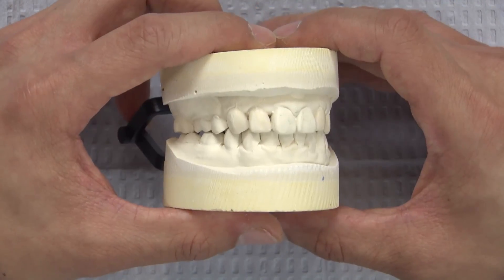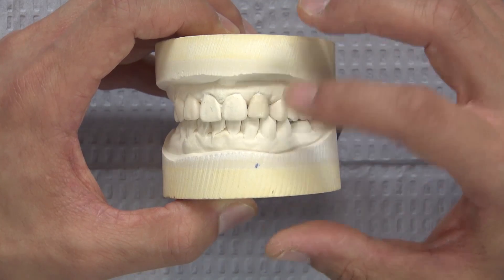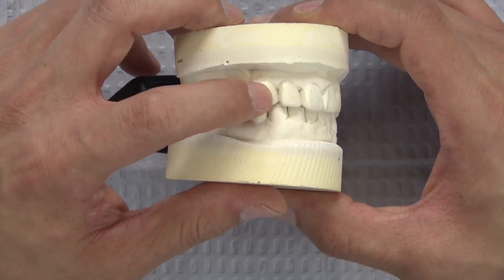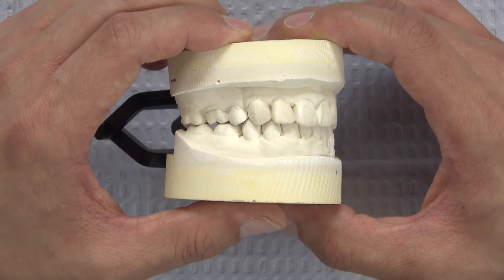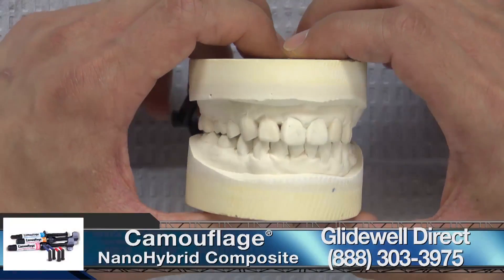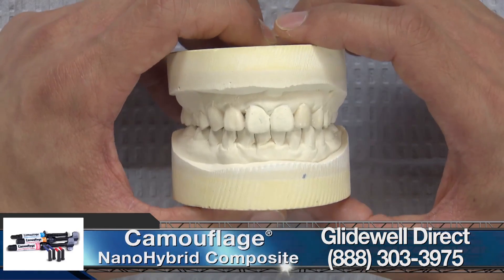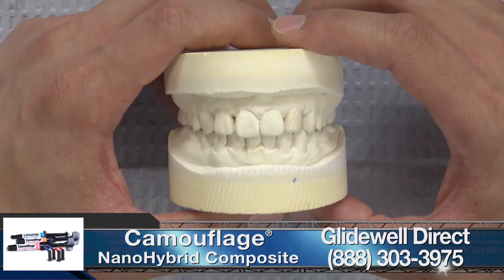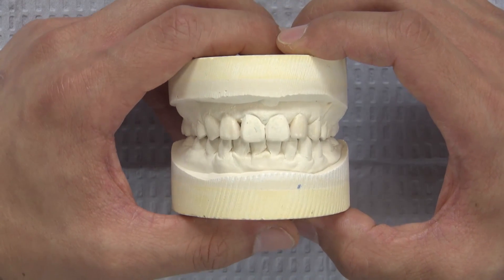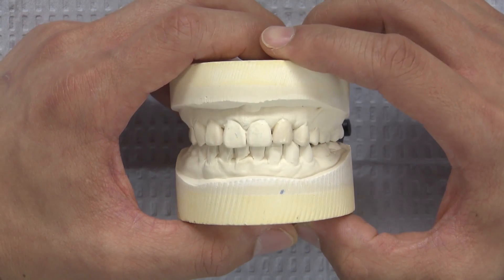For this case we are going to use the most minimally invasive approach. The only area we're removing tooth structure will be on the incisal edge of number 10, and the rest of the areas we will apply composite resin. The material I'm planning to use will be the Camouflage Universal — it's a nano hybrid composite and it has many desirable properties that will benefit both myself and the patient.